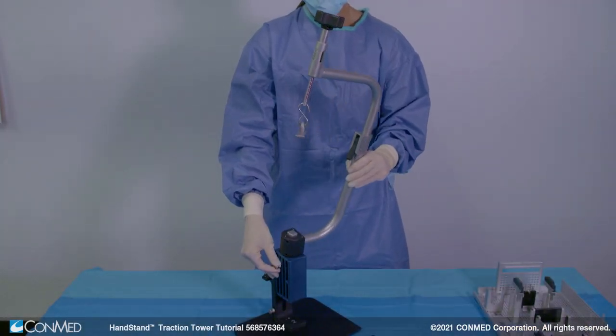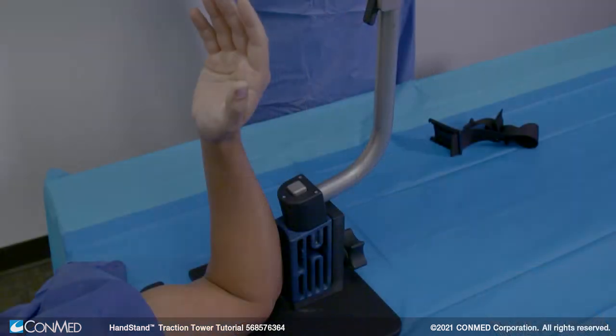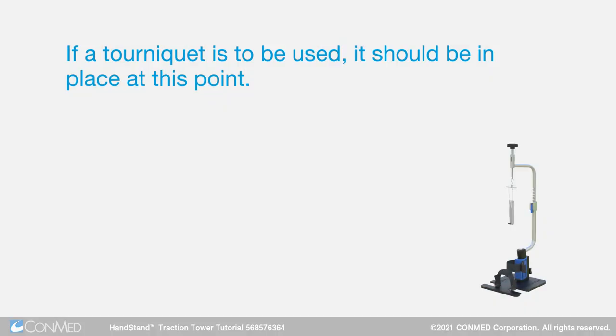To position the patient's arm for surgery, flex the arm 90 degrees and rest the elbow on the base plate against the upper tower. If a tourniquet is to be used, it should be in place at this point.